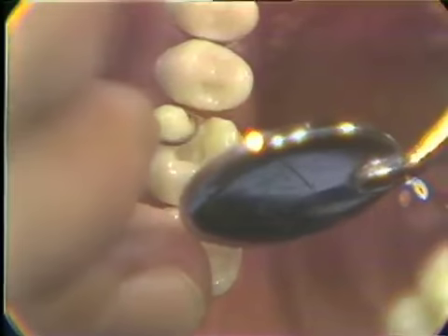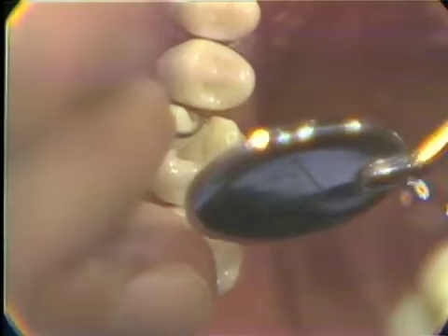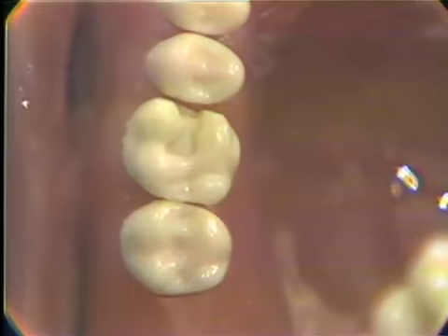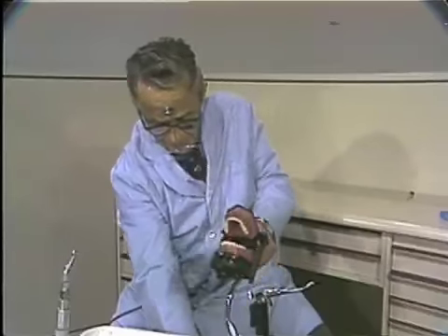You can see into the cervical that there is a bevel down across these two slices now, combining it all as one. For actually checking a slice and a bevel, it is important to really use a snap compound impression, which we will not do here today, but it is something that you should do as you do each of these preparations. I would like to show one more thing before we come to a conclusion, and that is the amount of taper that we have placed on this slice.